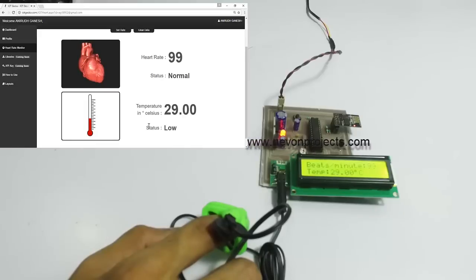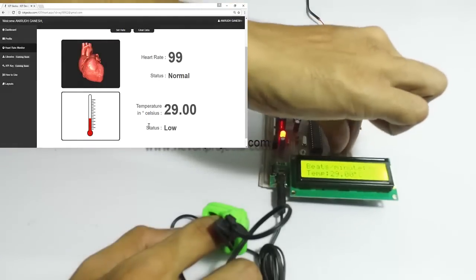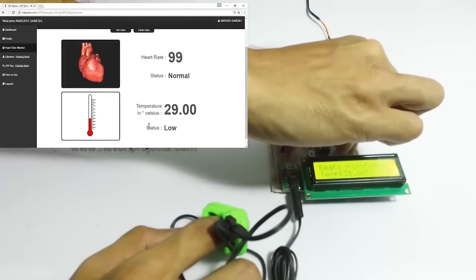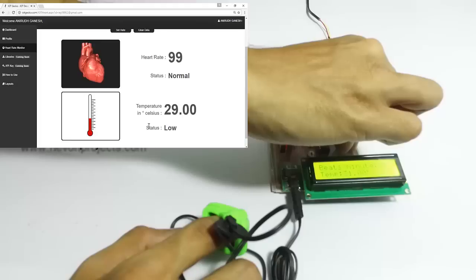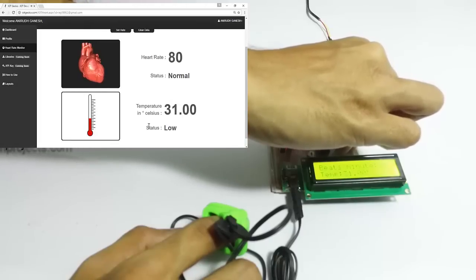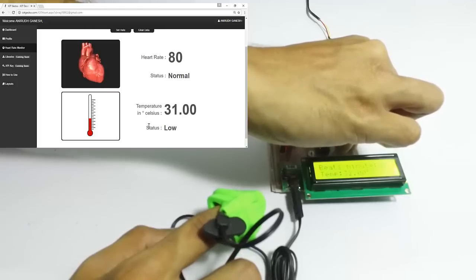As you can see, we have set the rates. Now let's hold on to the temperature sensor so that the temperature increases a bit — currently it is getting the room temperature. As you can see, it can monitor the heart rate as well as temperature.